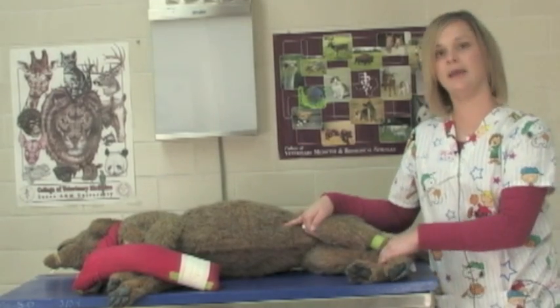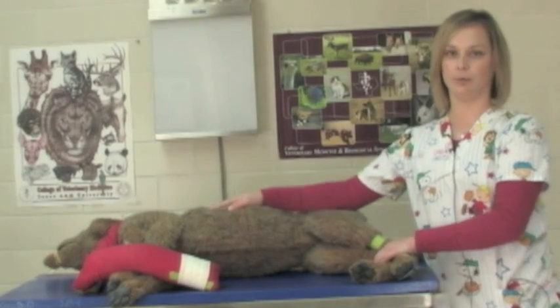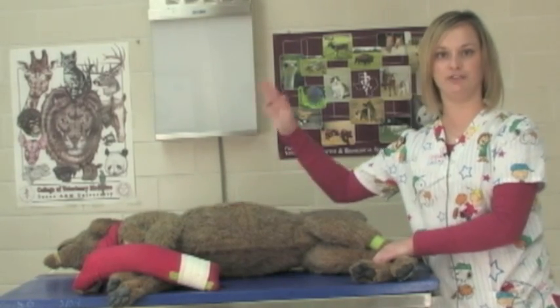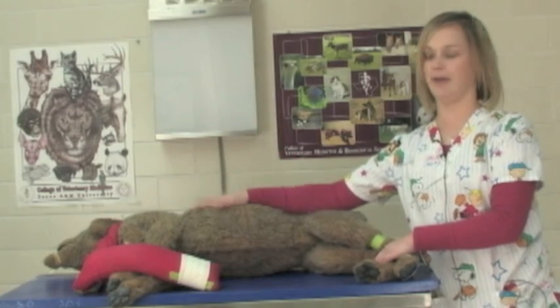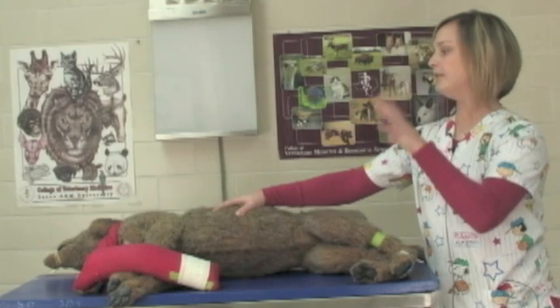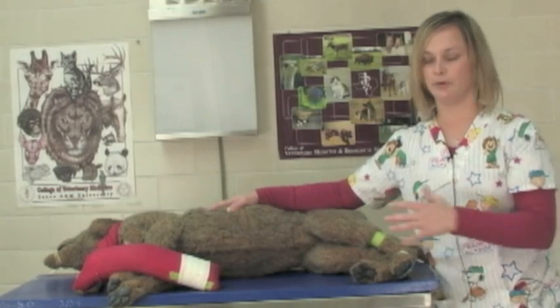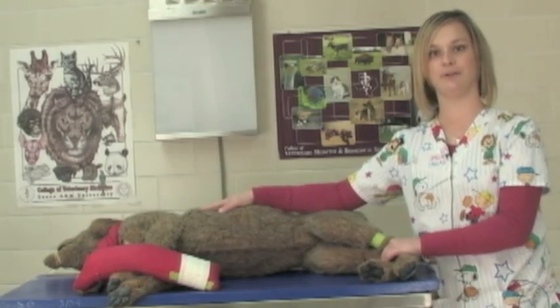Obviously, when they're awake, you want to be aware of the animal's head mainly because you don't want anybody getting bit. So the person up at the front of the head needs to be the most aware of what's going on — the emotions of the animal per se, how they're acting to this environment — because it can be a scary place if it's unfamiliar for them.